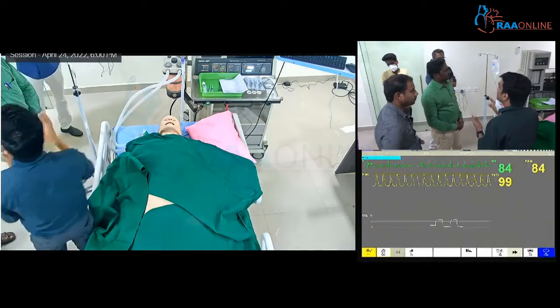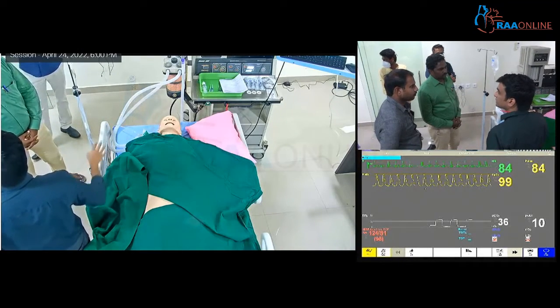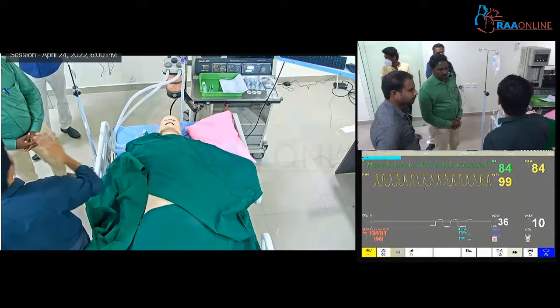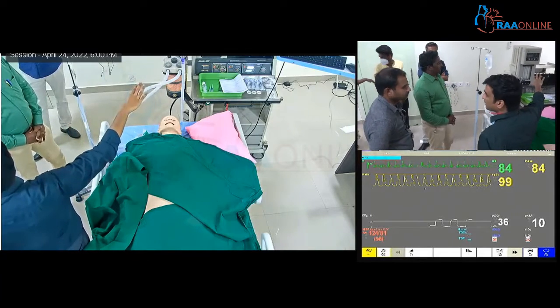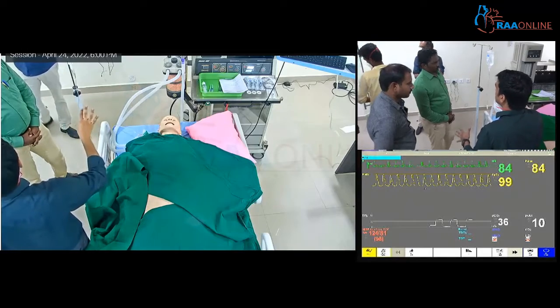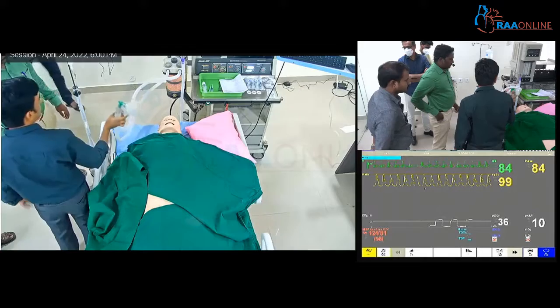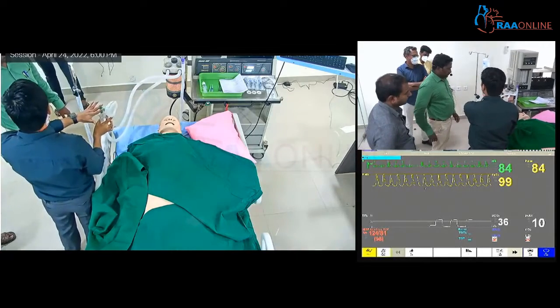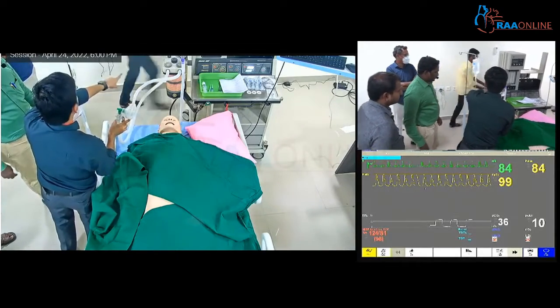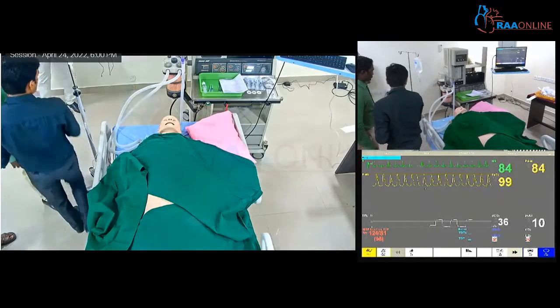Usually in your OT, is it going to be a similar setup? We don't have ETCO2, sir. You don't have ETCO2, but the monitor is going to be behind you. The workstation is also going to be behind you. This is how the normal setup is. And this is what we have as the circuit. We'll open the second cylinder. So this is the oxygen supply.